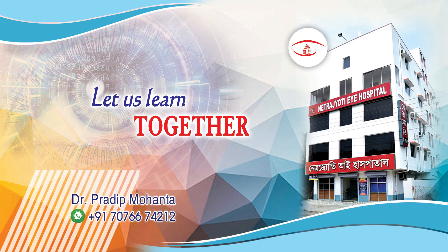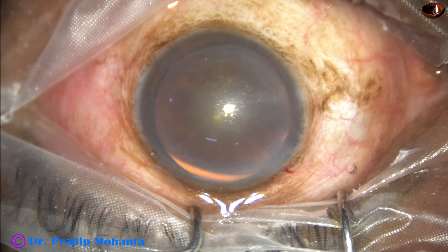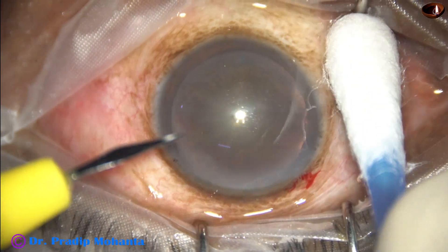Friends, welcome to my workplace for hands-on PHACO and SICS training. This is a very soft cataract; nucleus sclerosis is grade 2. Let us observe this surgery.